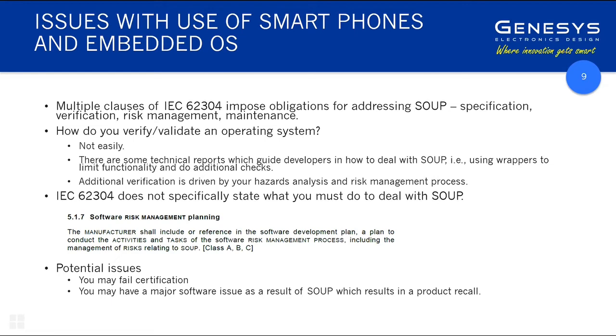So what it comes down to is, yes, if you have a system where the display, using a smartphone or an embedded OS display, is really a secondary source of information, or a secondary action that is not subject to a critical hazard occurring.